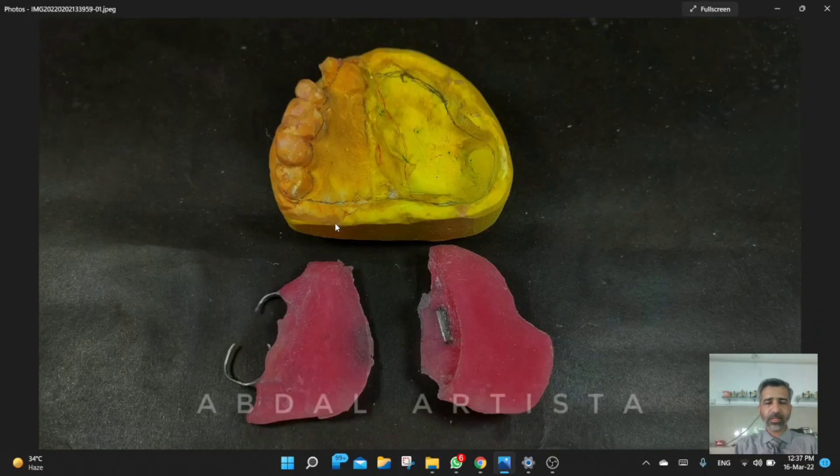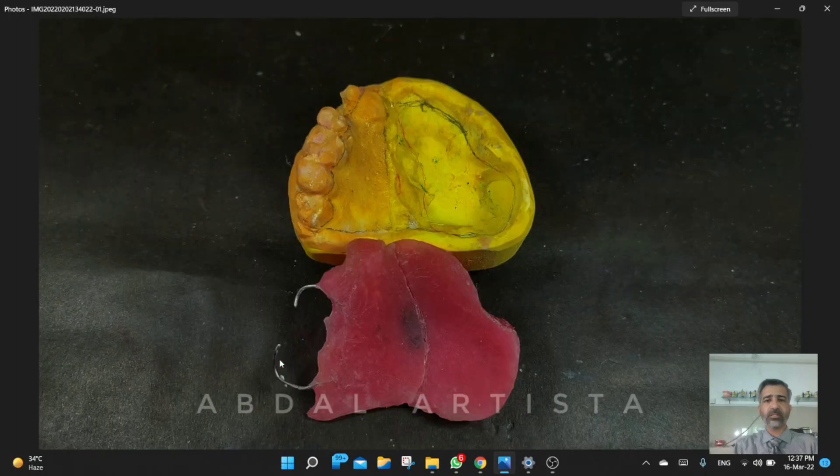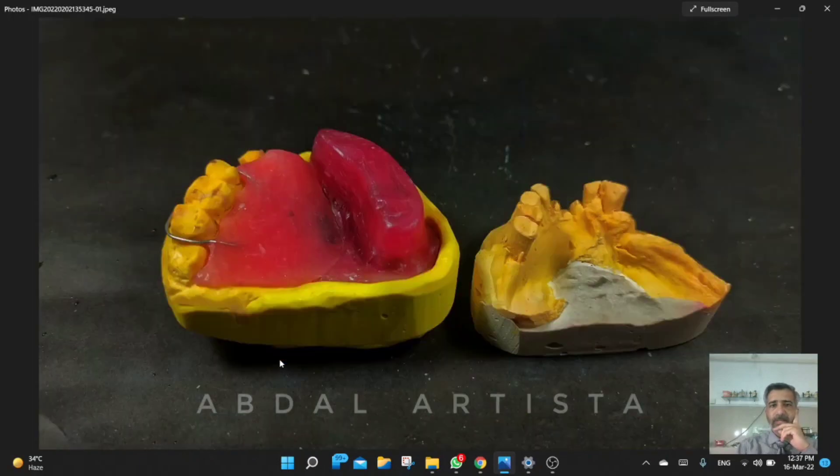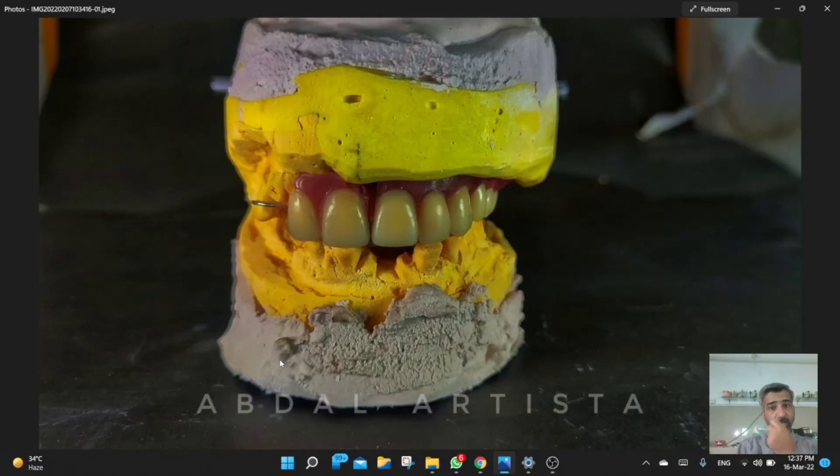This is the second half of the prosthesis — here is the first half, here is the second half, and this is how it will look when joined together. After that we fabricated the baseplates to assess the vertical relationship. Here are additional views of those baseplates.